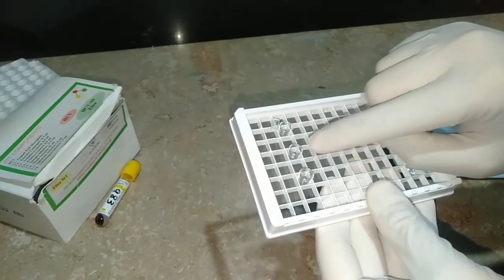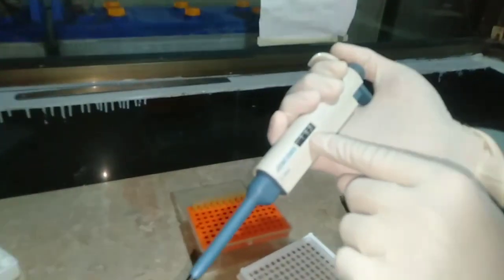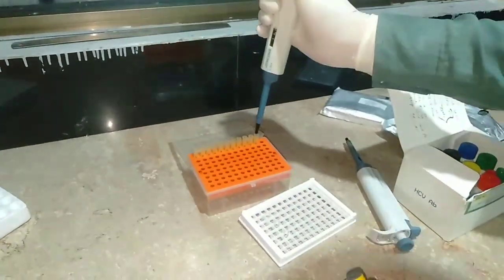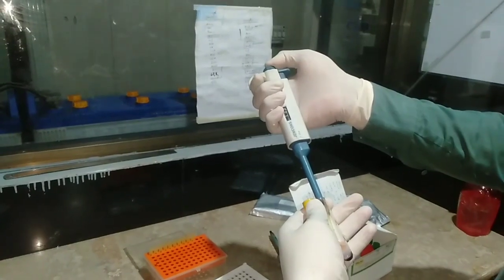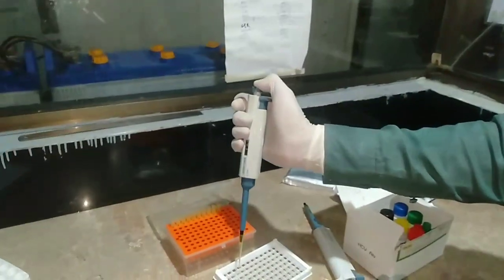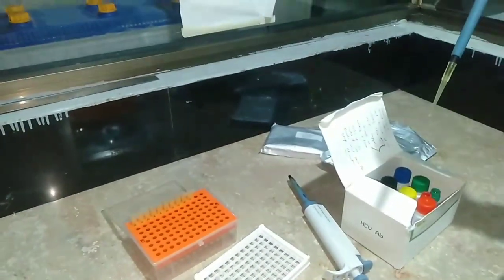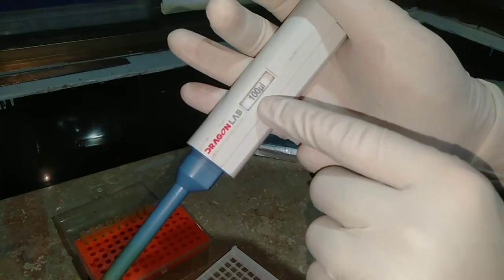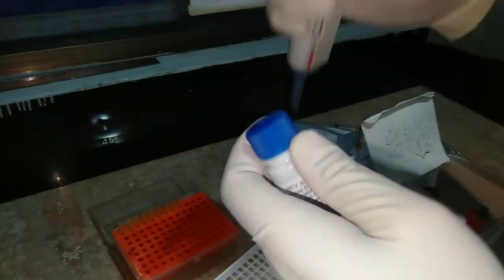Now we take the wells and arrange them into the micro titer plate, as you can see. Using the micro pipette with a clean tip, we set it to 10 microliters. We take 10 microliters of human serum and put it into the first well. Next, we take 100 microliters of HCV AB diluent.